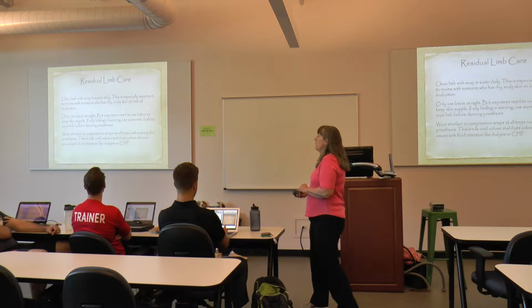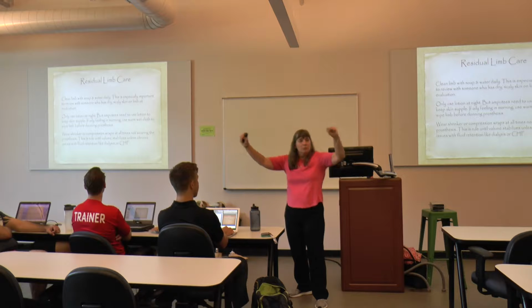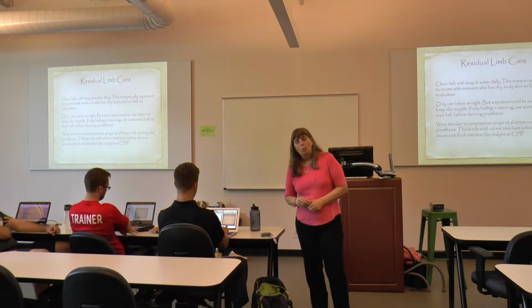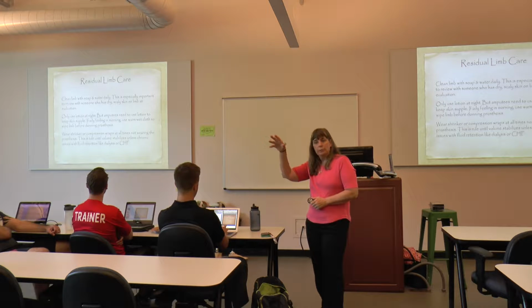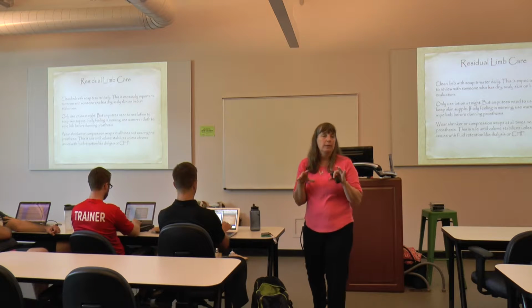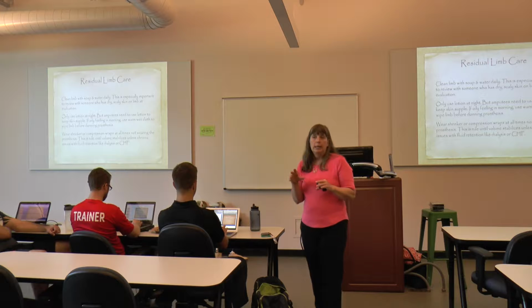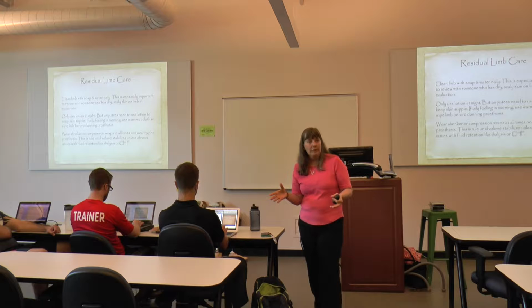Okay? They need to wear the shrinker. They think a lot of times, oh, I'm done with that shrinker, those compression wraps. No. You need to wear it at all times you're not wearing the prosthesis. Once we stabilize in getting your prosthesis on all your awake hours, or most of your awake hours, and we stabilize out how many socks you're going through. Now, with the first one, it's not uncommon, let's say the prosthetist put pads in there and you're wearing 5 ply first thing in the morning, and after you've been on it a couple hours, you go up to like a 7 ply. But it's the same story every day.